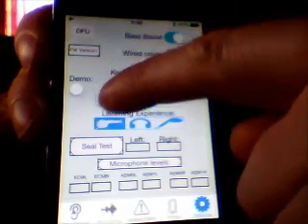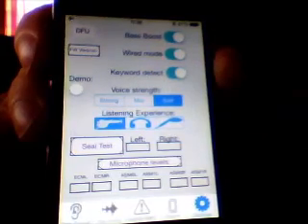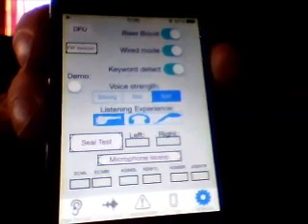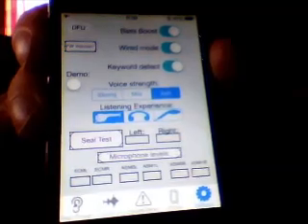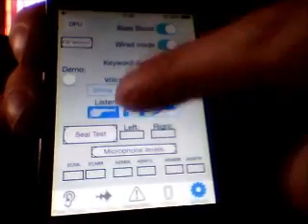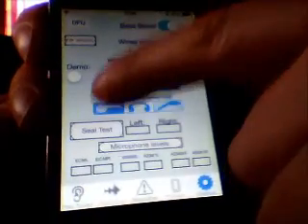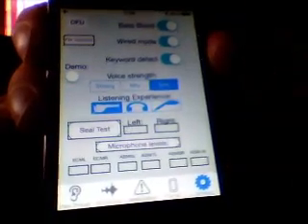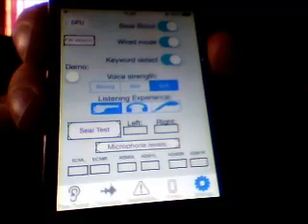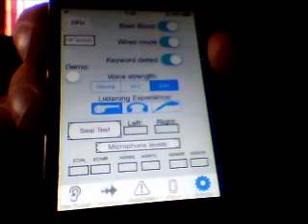Now the voice strength menu here, this sends a BTLE command to the earphone hardware for selecting the strength or loudness of the earphone user's voice. Now this menu here, the listening experience menu, this sends a BTLE command to the earphone hardware for selecting the equalization filter that's applied to the earphone loudspeaker.